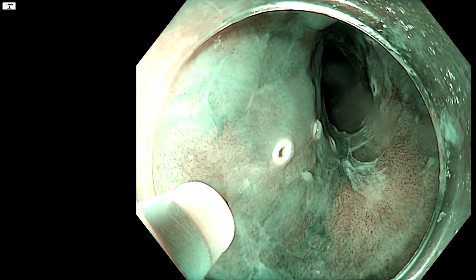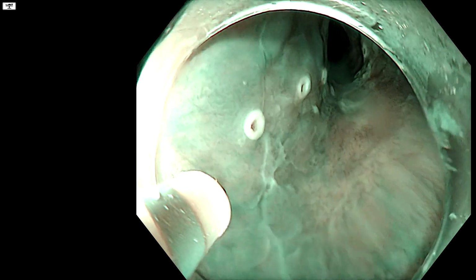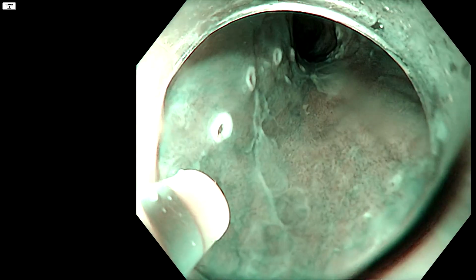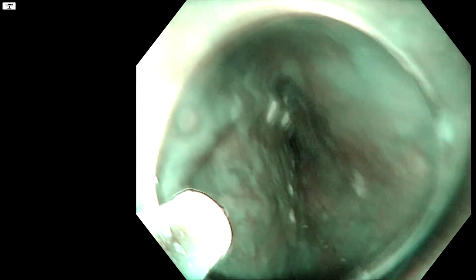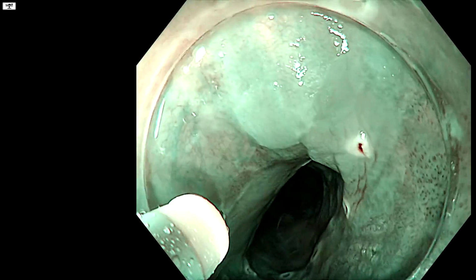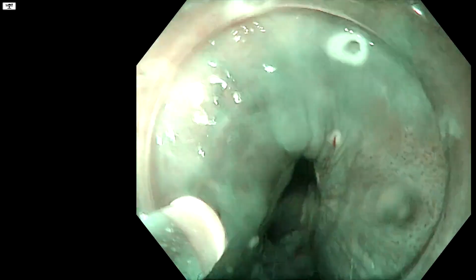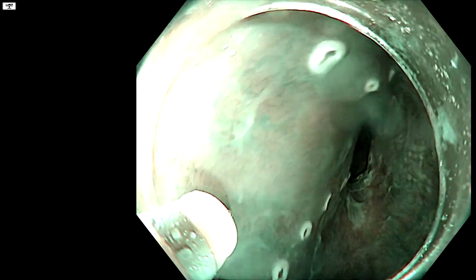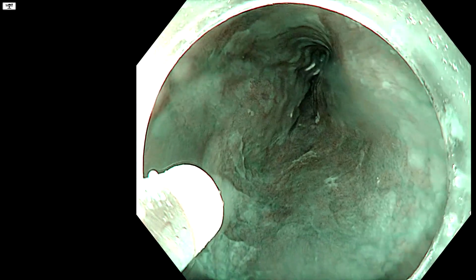Nice article in, I think, Endoscopy this month about that sort of thing, especially where it's dysplastic. Staged EMR to prevent, ESD, sorry, to prevent stenosis. And now we need to see how far we need to come up here. So actually already we are looking at that, and I'm also looking at this thing at the 12 o'clock and thinking probably that's all right, but we'll check with the iodine. Already this is the only part we're sparing of the circumference, so yeah, already we're quite broad.